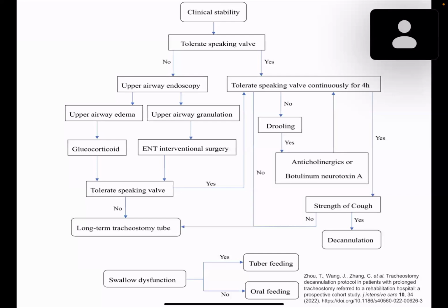Double lumen tube Portex is available in the market and it's around 4,500 or 700 rupees, and it is only viable for a few days. Then it gets infected. So that's a big problem. For an acute care setup, maybe it's okay, but it has its own disadvantage because metal is rigid and the attendant has to learn. So all my patients in Bhubaneswar right now are on metal.